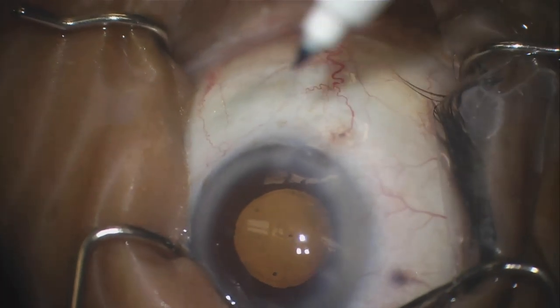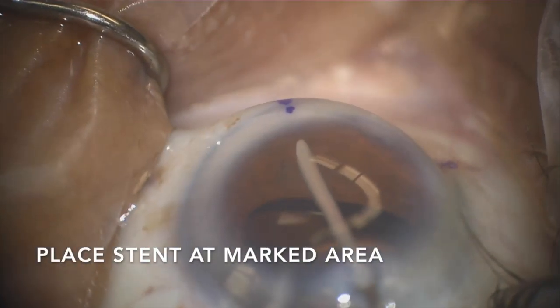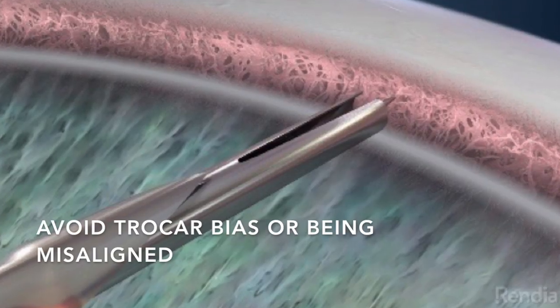Now, what are some surgical pearls? One pearl is that you can enhance your ability to gain access to the robust collector channels by first marking the most prominent episcleral vessels that correlate with these outflow highways. Try to place your stents at these locations — they typically correspond with areas of increased pigment in the trabecular meshwork. Another pearl is to master the stent insertion on the first try into the TM by making a firm dimpling of the TM with the insertion tip prior to pressing the release button. This allows for secure seating of the stent. If the dimpling is too light, the stent won't seat well and it may actually loosen and float into the anterior chamber. This can occur when the trocar is not perfectly centered and the insertion tube is not properly perpendicularly aligned with the trabecular meshwork tissue.